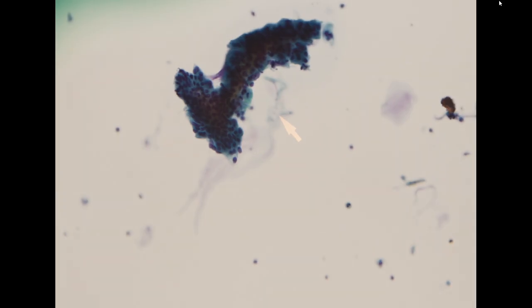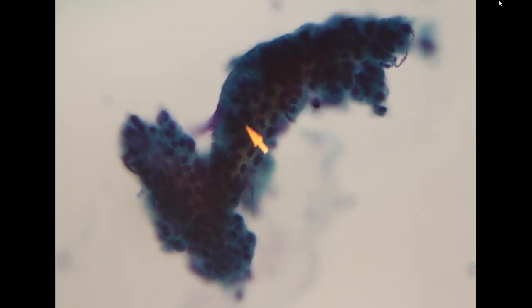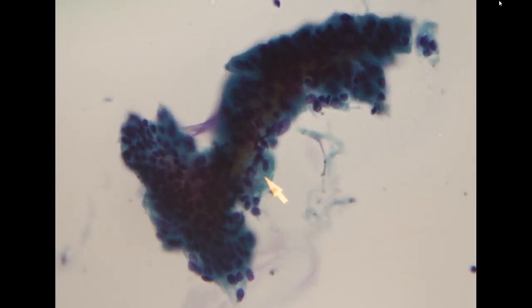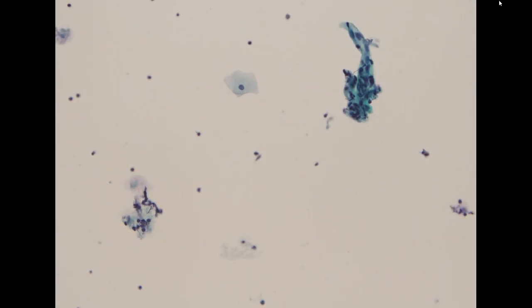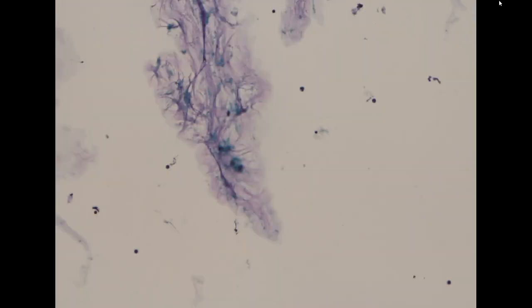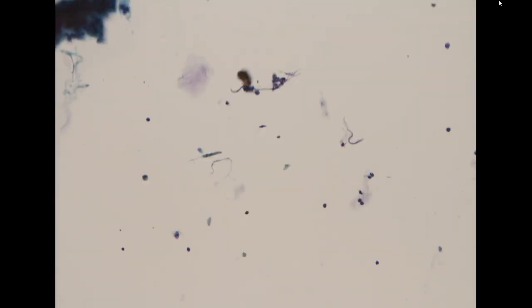Unfortunately, the specimen only has very, very scant cells. Again, in this cluster you can see abnormal mucinous differentiation with three-dimensional architecture. So this suggests it's likely a well-differentiated mucinous adenocarcinoma. We do have a corresponding core needle biopsy. Again, you see extracellular mucin. It's more than usual.